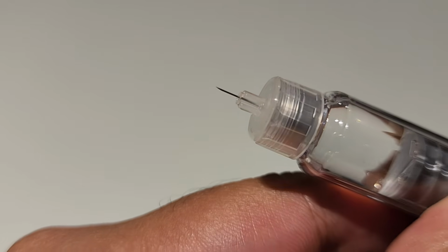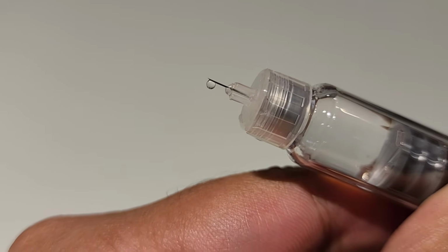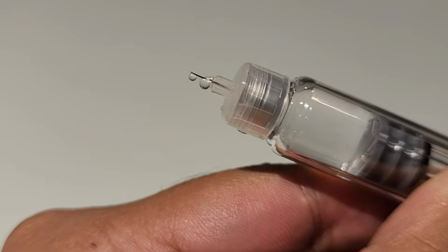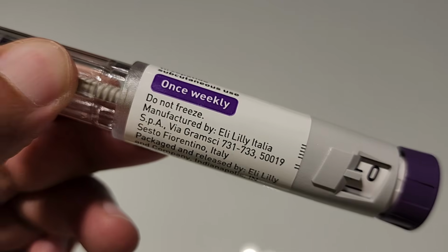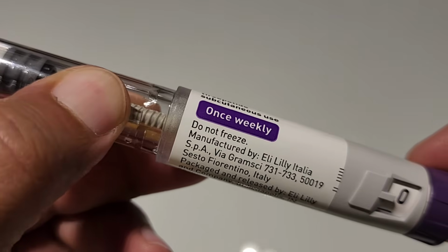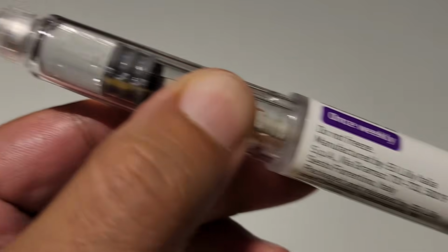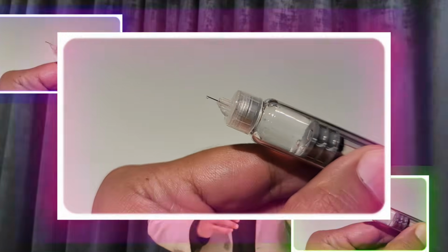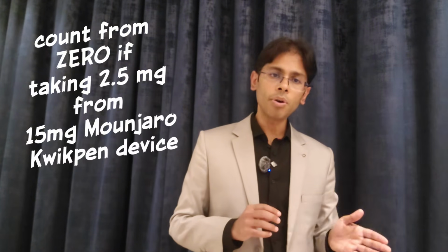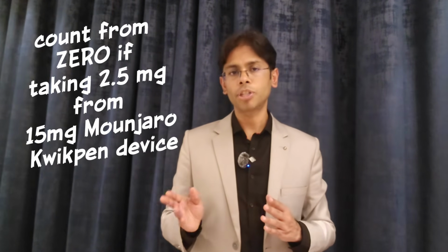Now, if those few drops are being used from a 15 milligram pen device, they can be quite significant. For example, if someone is planning to take a 2.5 milligram dose from a 15 milligram pen device, the few drops that come with a priming click can make a significant difference. So I would prefer to start counting from 0 if you are taking a low dose from a high strength pen device, because the small volume might contain a dose which is quite significant.